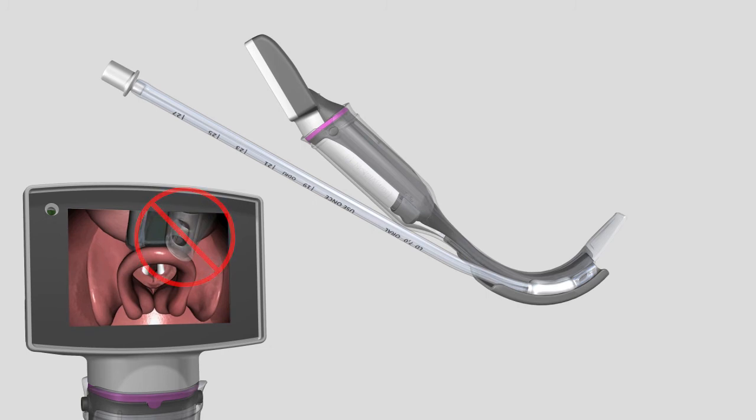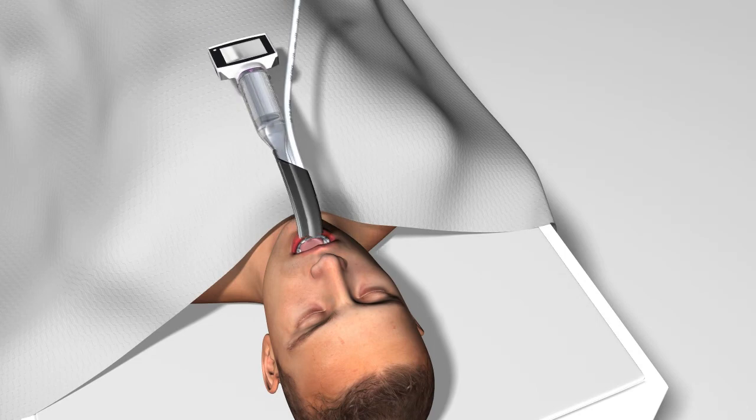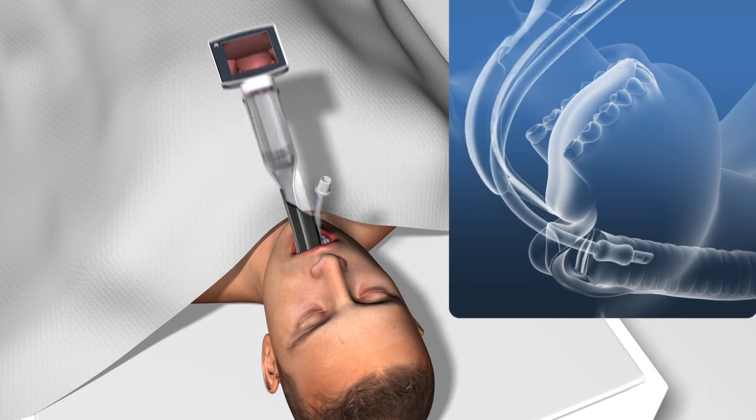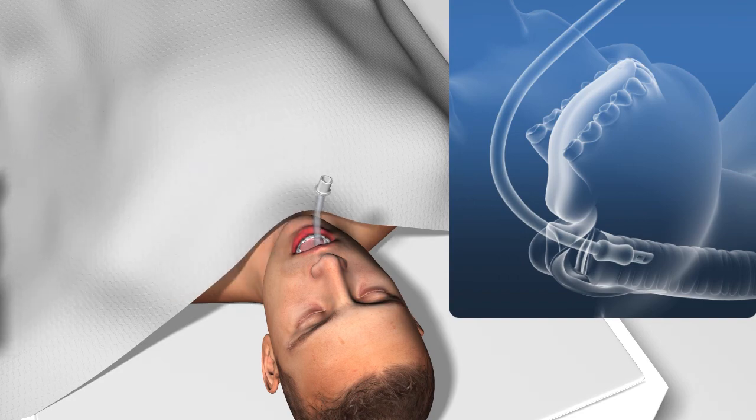Alternately, the ET tube can be inserted into the channel after the blade is already in position and the vocal cords have been visualized. Advance the tube slowly and watch for the cuff to pass through the vocal cords, manipulating the tip as needed. Once the tube is inserted, separate it from the blade by pushing it away from the soft molded channel and retracting the blade.